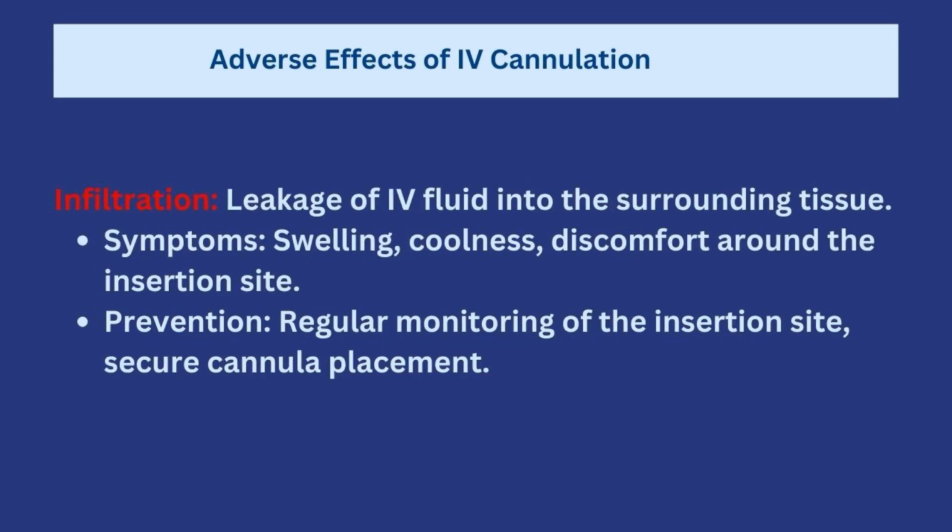Next is infiltration, where the IV fluid is leaking into the surrounding tissues instead of directly into the vein. And the symptoms include swelling, coolness, and discomfort around the IV cannula insertion site. And the prevention is to regularly monitor the insertion site and secure the cannula placement. This is why you always see that when the cannula is inserted, they always secure it either with a plaster or a dressing around that cannula.